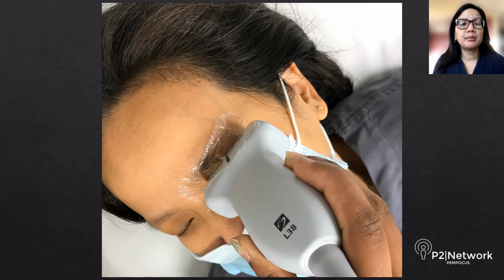So for this exam, have your patient supine on a stretcher. You can also slightly elevate the head of the bed by about 30 degrees if that's more comfortable for your patient. You're going to have the patient close his or her eyes, and then you're going to apply a thick layer of sterile surgical gel on top of the closed eyelid and eyelashes. Then place your Tegaderm on top. Then place another copious amount of sterile surgical gel on top of the Tegaderm.